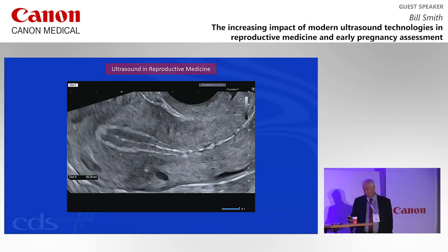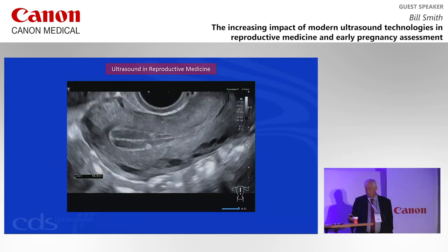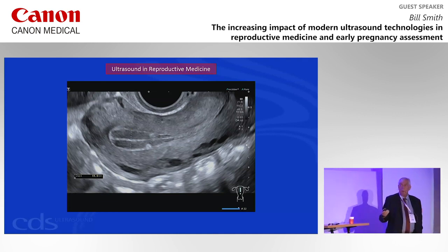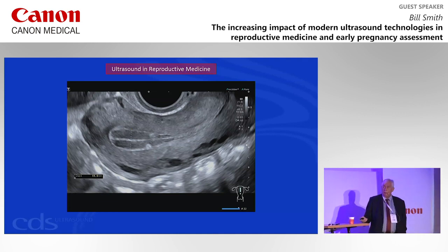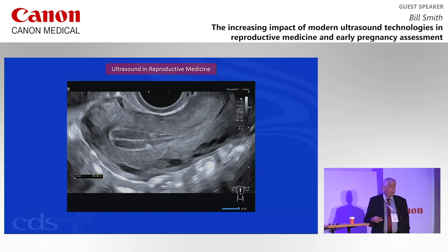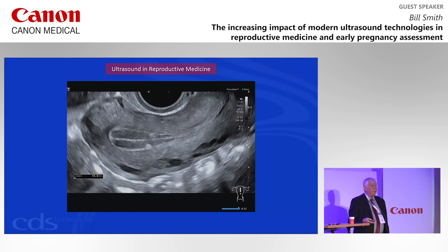And likewise, if we take this example, 11 millimeters, that's not a good endometrium in terms of imminent ovulation. Again, you can see there's no glandular activity there. So this is the importance of having good grayscale if you're offering any kind of fertility investigation, fertility treatments.